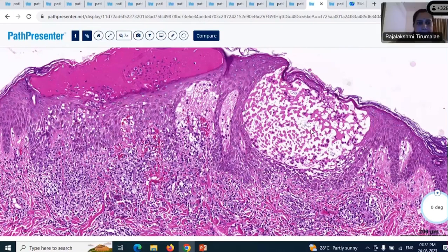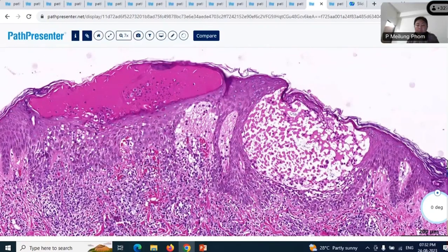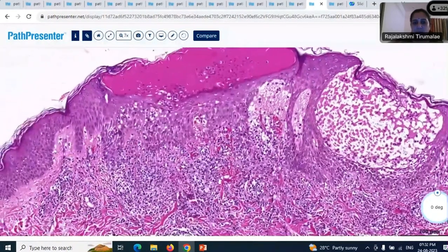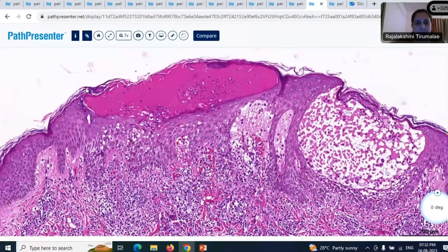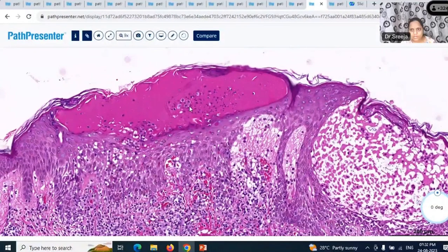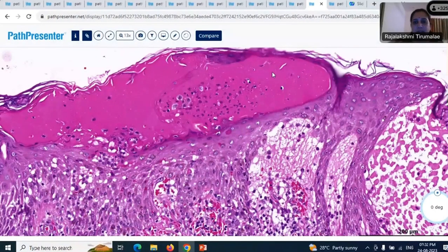Okay. And rounded keratinocytes are seen. Where is it? What is the level? Where is the blister located? In the epidermis. Okay, it's intraepidermal. It's within the epidermis. That's right. Okay, then what else? What is this? These are rounded keratinocytes, ma'am. You mean these? Yes, ma'am. Okay, but what is this? What is all this pink stuff in the background?